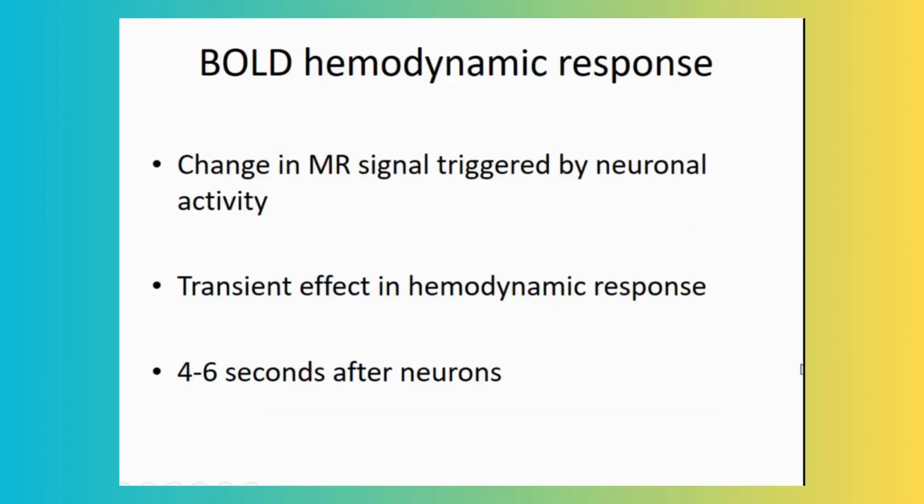And this effect is very transient, only 4 to 6 seconds. That increased oxygen level doesn't last long. Again, on the graph, when there is more oxyhemoglobin in that area, because of more perfusion, oxyhemoglobin goes very high, and there is a washout of deoxyhemoglobin in that area. Its effect is transient, only a few seconds. It comes back. So this oxyhemoglobin causes the BOLD signal.